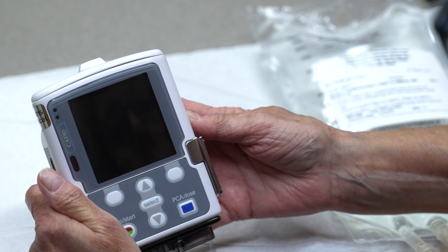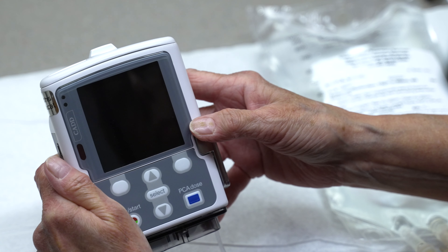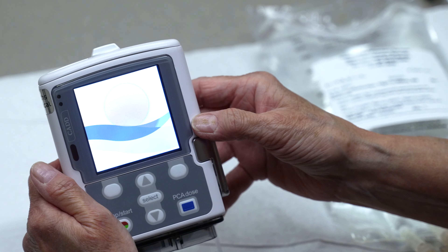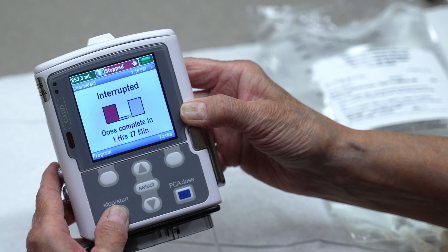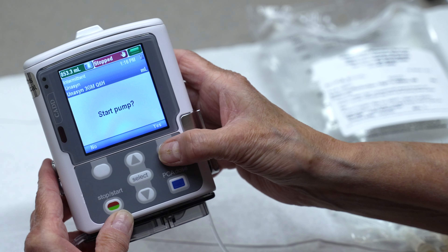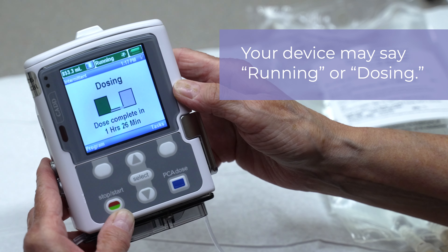With new batteries, you can either set aside your pump for future use or continue your current therapy. If you are continuing your infusion therapy session, turn the pump on by pressing the power button located on the right side of the pump. Press the start/stop button. The pump screen will display "start the pump." Press the yes button. The pump is working when the display says "running" and the green light is flashing.